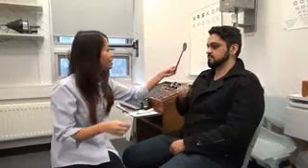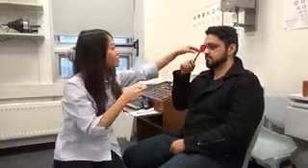Okay, so now I'll be putting it in an opposite direction. So I'm just going to repeat the procedure. So do you see the light? Yes. And do you see a red line? Yeah. Is it vertical or horizontal? Horizontal. And where is the light in regards to the red line? It's on the line. On the line, so spot on the line? Yeah. Okay. That's good.